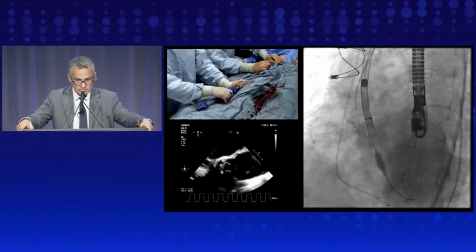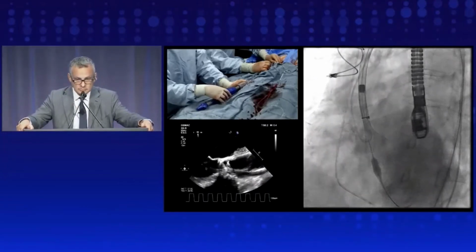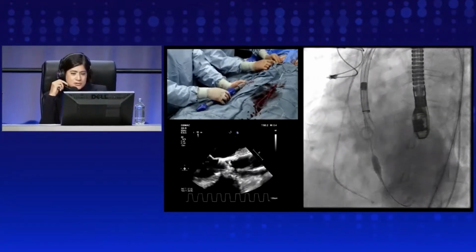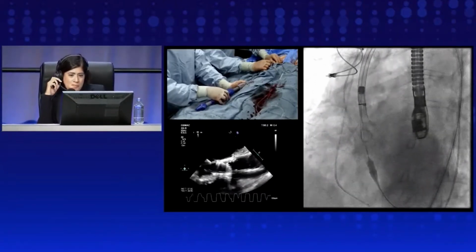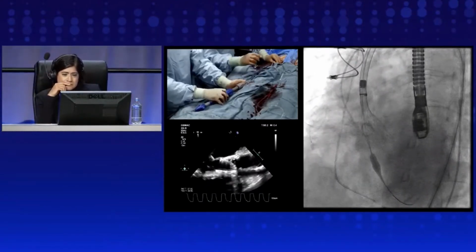Good. So Mark, it's Anita Asgard. Just a question. For the Sentinel, since you have such extensive experience, have you noticed any increased material in the Sentinel when you do these Basilica cases, or not really? Not for the Basilicas. We have not seen much at all. No. You know, we've done TMVRs as well, and it might be unpredictable.